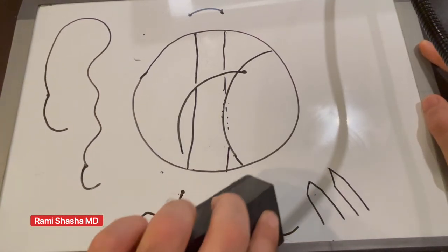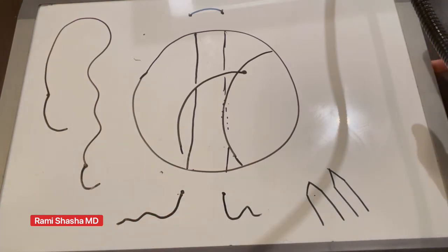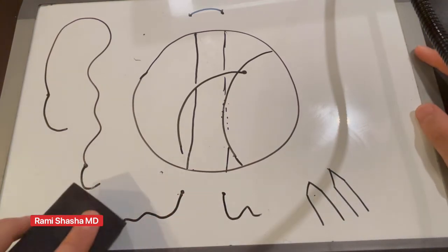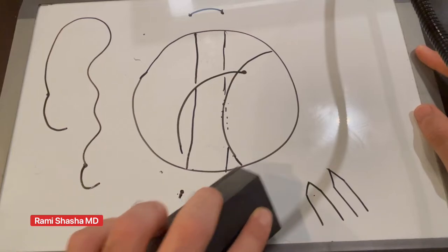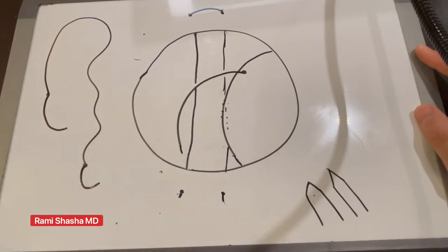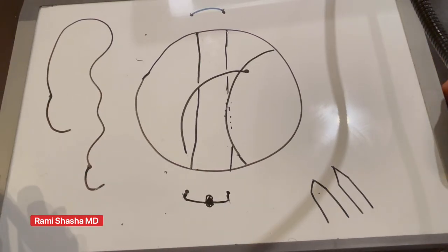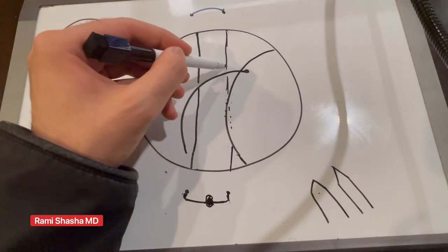You're left with the two suture strands, then you can tie however you want, three one one, and then you're going to be left with a closed end like that.